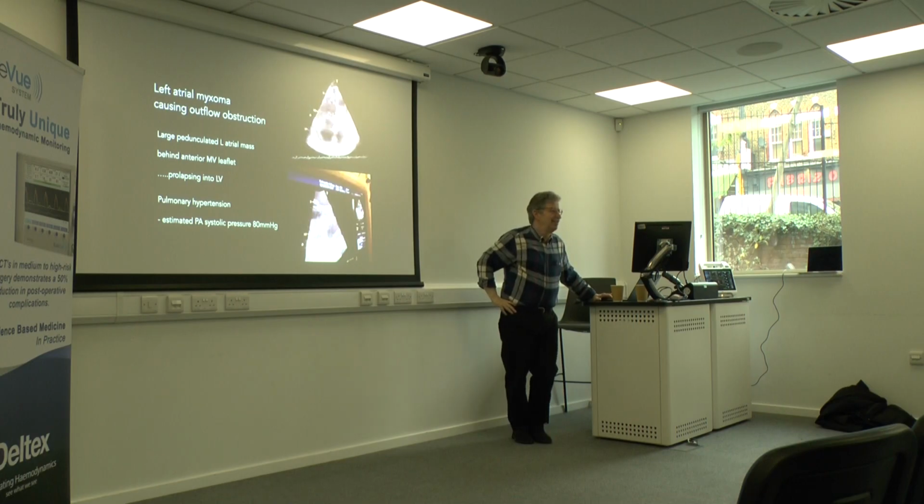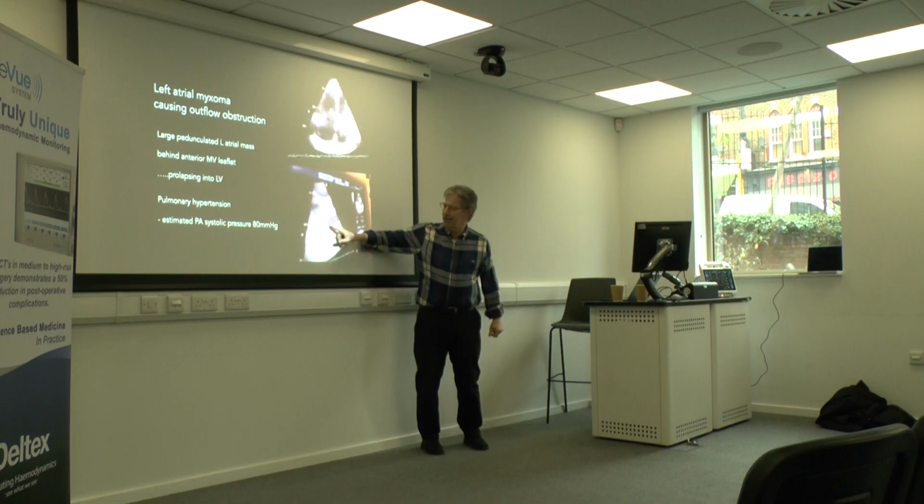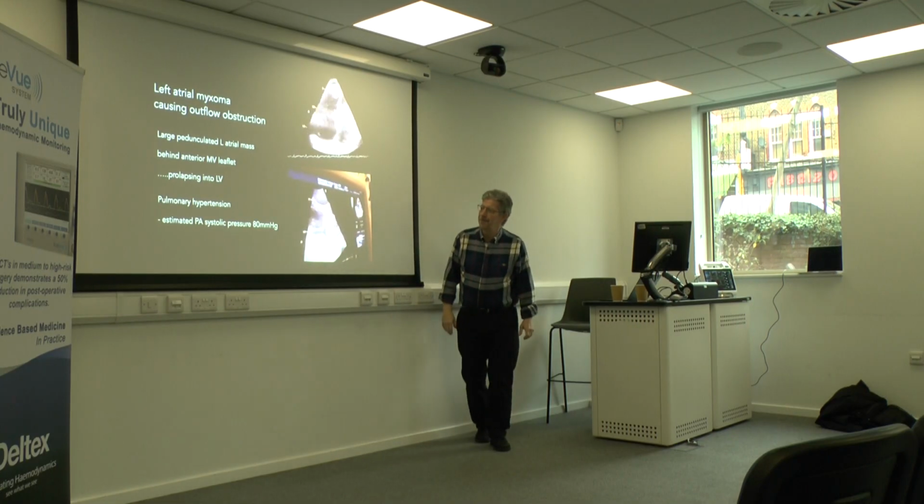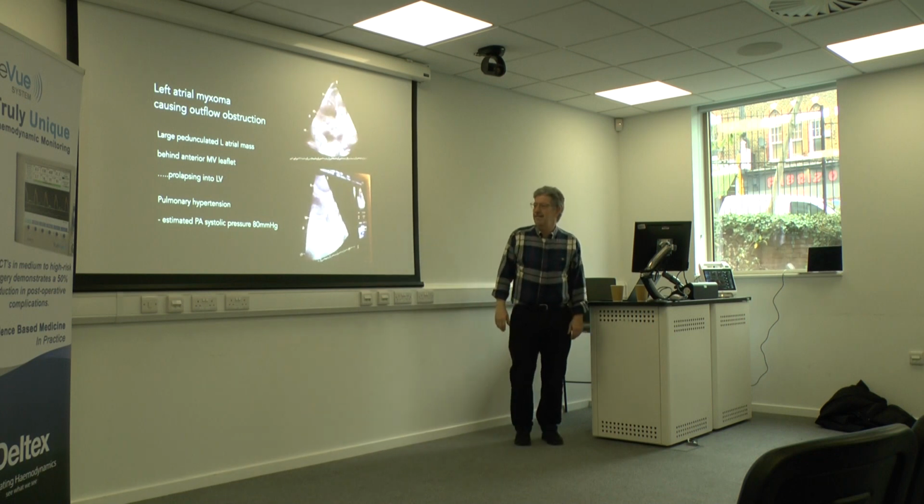Myxoma. Blocking, so you can see it here. You can see this plopping in and out of the mitral valve. Nice little myxoma. And she had pulmonary hypertension.